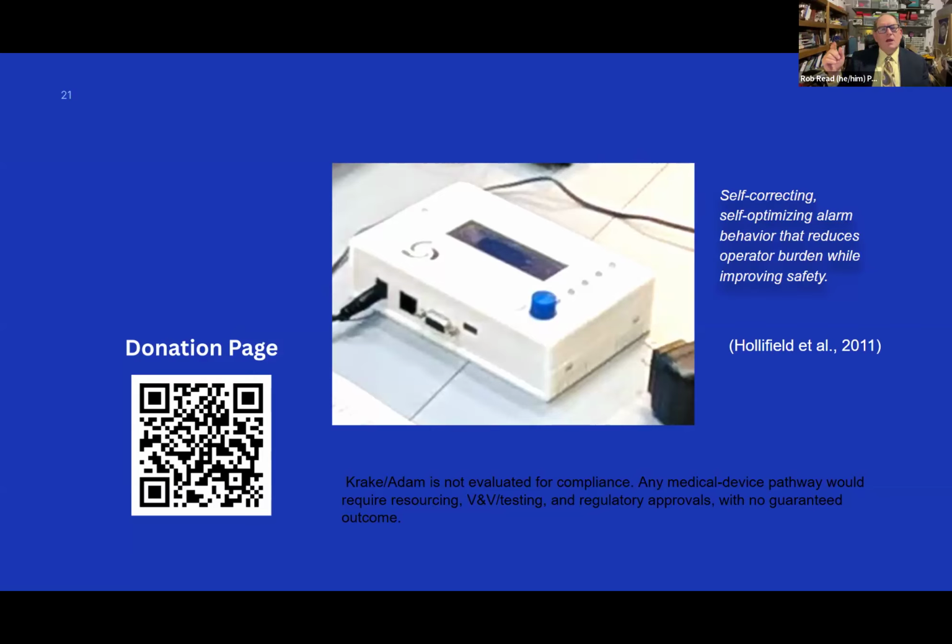They're currently making a new version that has a rotary encoder and a larger speaker, so that the speaker can produce loud messages in recorded human voices. That'll be a major feature going forward, which the previous version didn't have, which will make this really good.